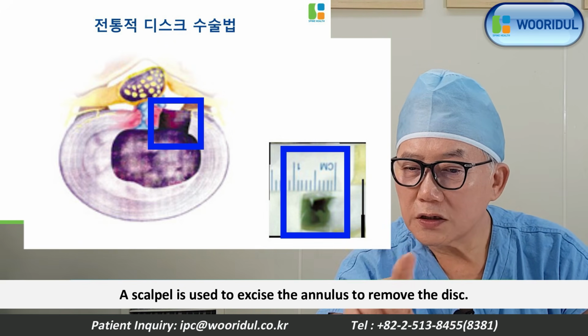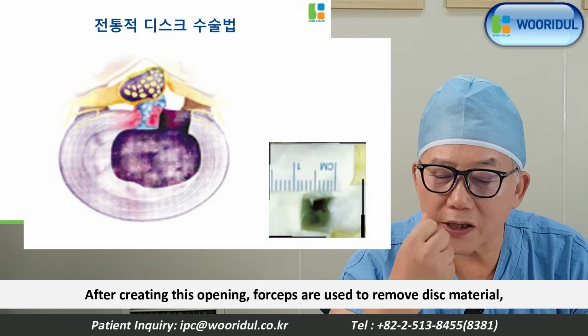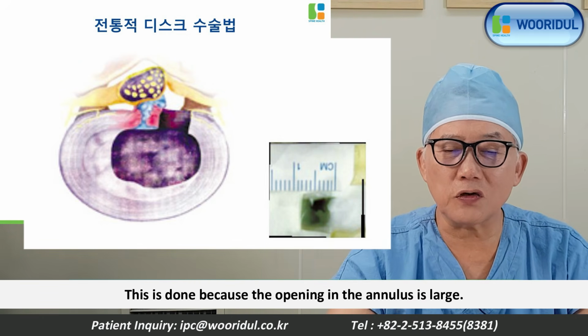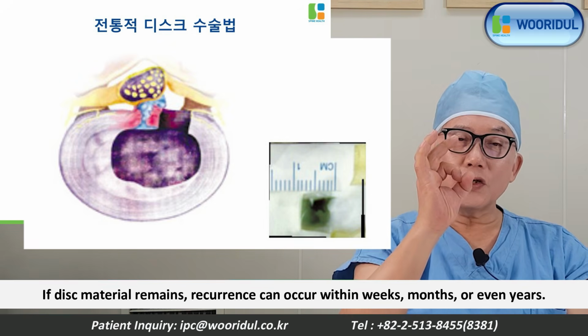A scalpel is used to excise the annulus to remove the disc. After creating this opening, forceps are used to remove disc material, and the remaining disc is often scraped out. This is done because the opening in the annulus is large. If disc material remains, recurrence can occur within weeks, months, or even years.